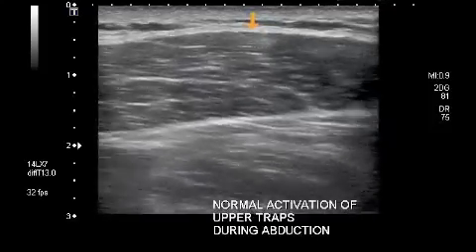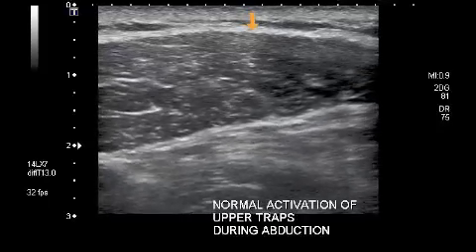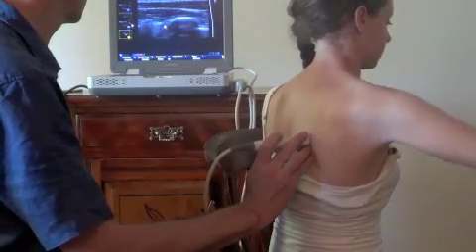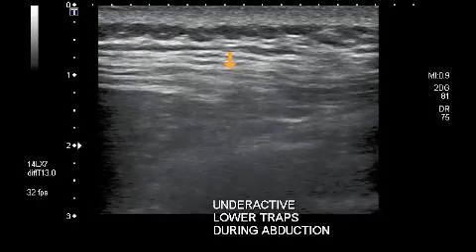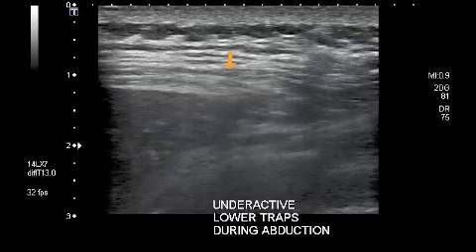With postural re-education, normal upper trapezius activation is achieved. Also assess the activity of the lower trapezius during abduction. If underactive, lower traps may need to be facilitated during the retraining process.